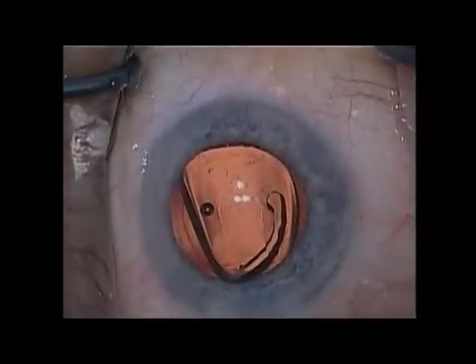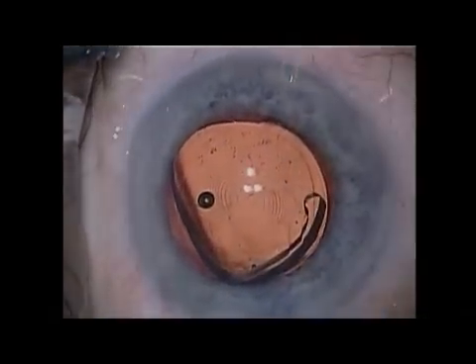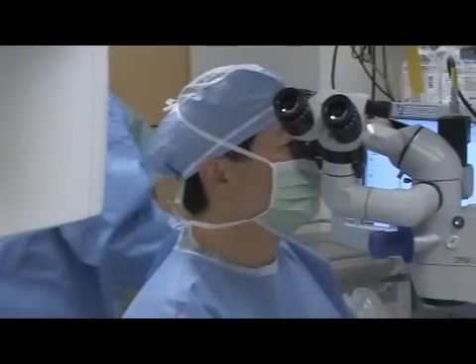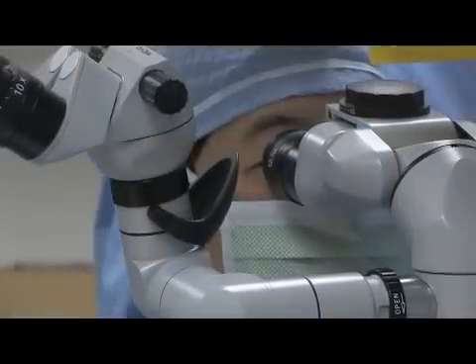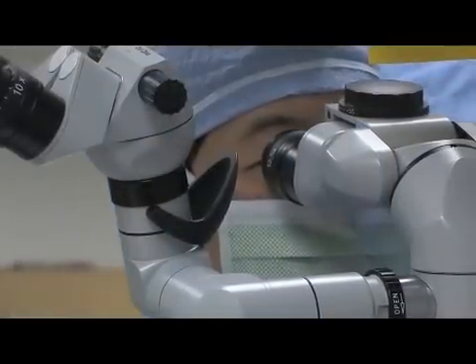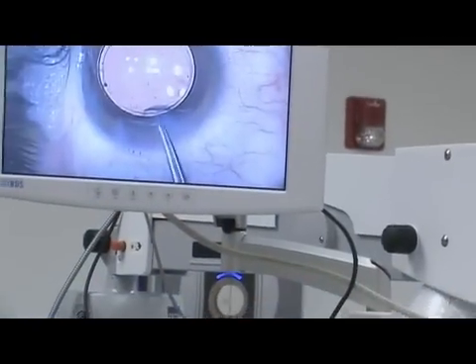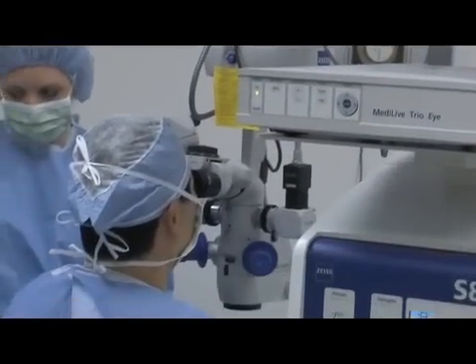In terms of where else this would be of clinical rather than purely aesthetic benefit, I think really with a small pupil, this is where the added luminance of the red reflex pays off. Cases like a Flomax patient, or simply a patient that doesn't dilate very well — the surface area of the pupil is reduced, and you don't ordinarily get as good a red reflex. Being able to use the Lumera to improve that is going to be a significant advantage. I think it will probably also make a difference when you're looking at a small tear in the anterior or posterior capsule — times when you're just not sure: is it a wrinkle, is it a tear? Having that extra 10–20% resolution can make a clinical difference.